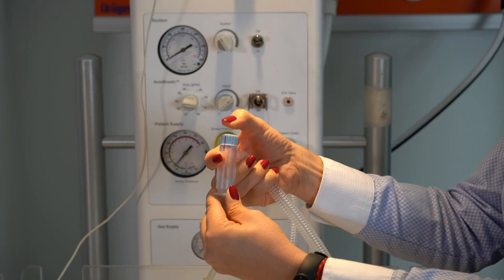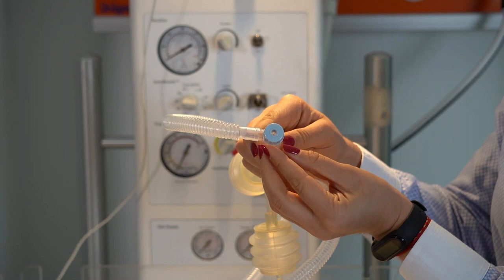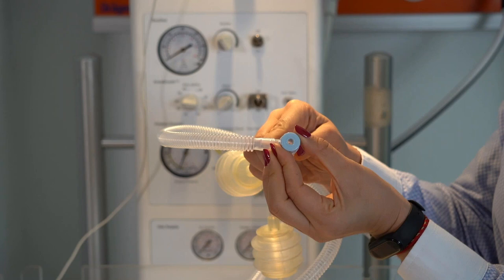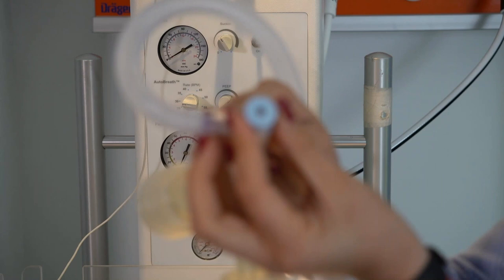And you see here on the top of the T-piece resuscitation circuit, you can increase or decrease the PEEP that we are delivering to our baby. So let me move it a little bit closer. Let me see if it can focus. Okay, I apologize for that.